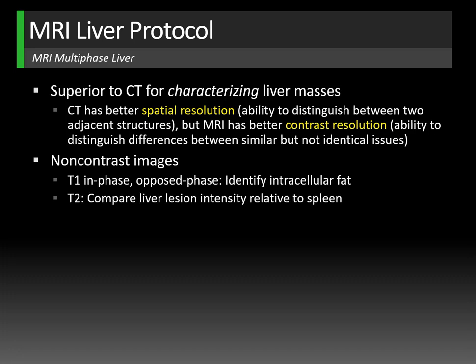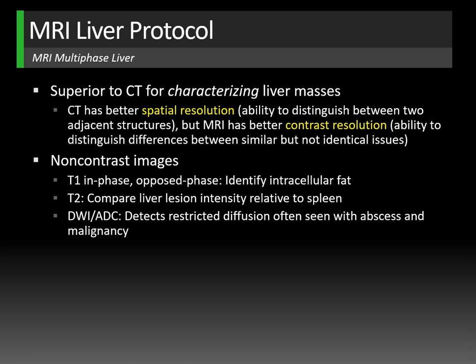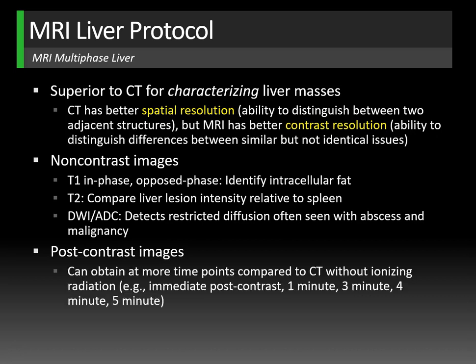T2-weighted images are helpful to compare liver lesion intensity relative to the spleen. Cysts and hemangiomas tend to be very bright relative to the spleen, whereas focal nodular hyperplasia and hepatocellular carcinoma are often iso-intense or slightly hypointense. Diffusion and ADC sequences are great at detecting restricted diffusion — helpful in characterizing abscesses, which often centrally restrict diffusion, compared to malignancy, which, if rim-enhancing, will often peripherally restrict diffusion due to dense cellularity. With MRI, we can also obtain subtraction images — post-contrast minus pre-contrast — to reveal absolute enhancement, helpful for intrinsically T1-bright lesions.